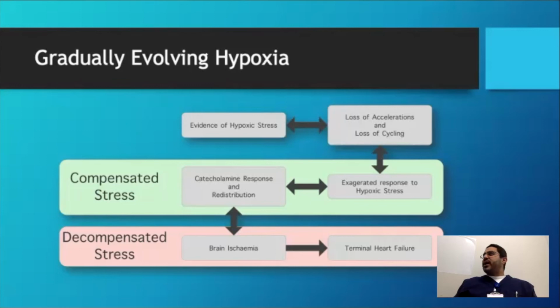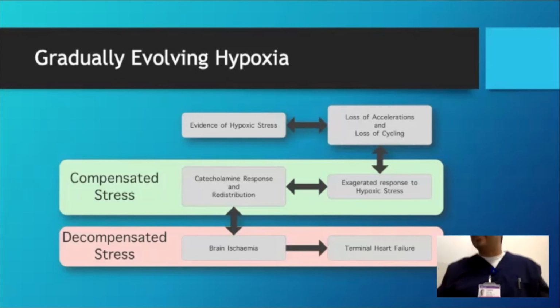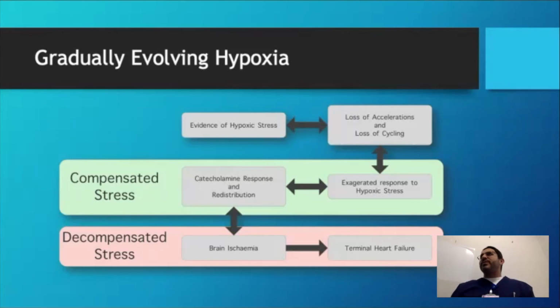You're comparing it to itself. So you need to have enough time to actually determine what's normal. You need to start at a normal point, have enough time to determine a normal point, and have enough time for it to become abnormal and show the changes. If you're starting from an abnormal point, somebody who's already hypoxic, you can't test it.